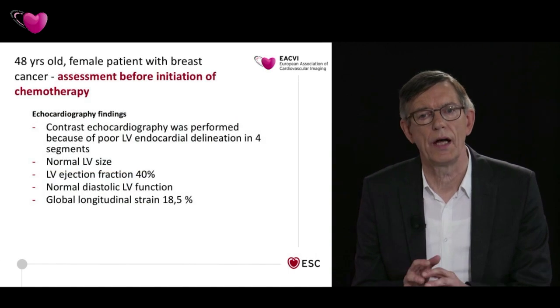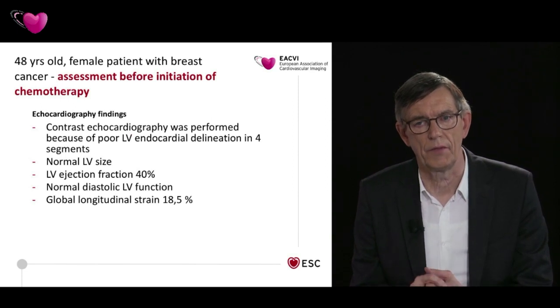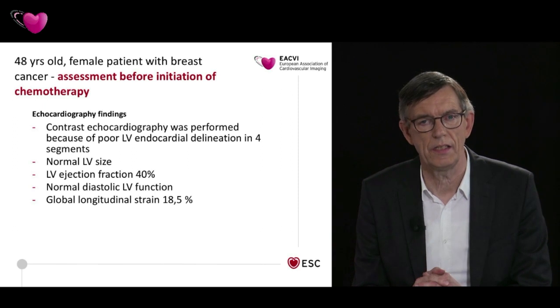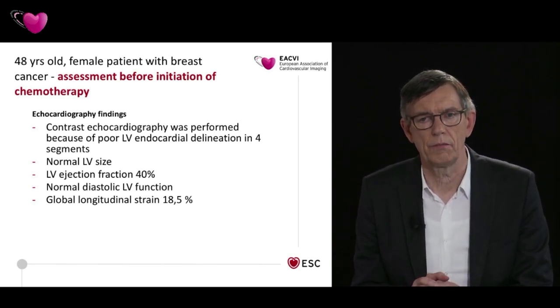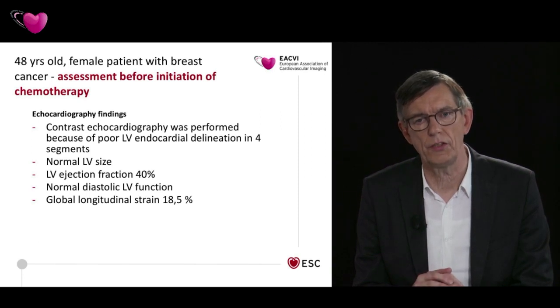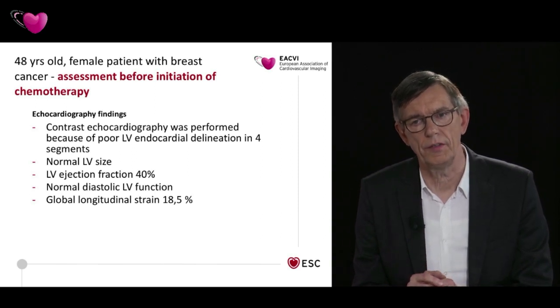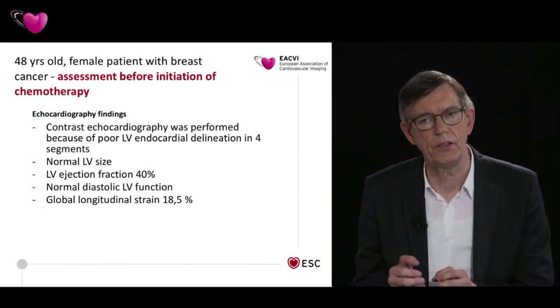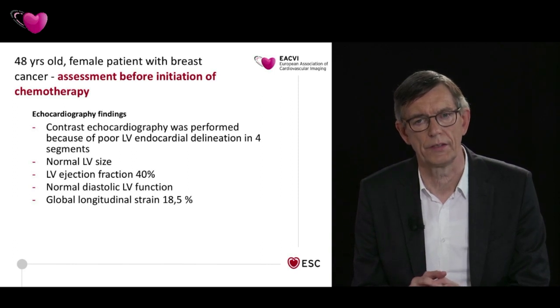Now let's go to a case. I will just give you the results of the assessment, and we'll look at the images later. This is a 48-year-old female patient with breast cancer, and she was assessed before initiation of chemotherapy with trastuzumab, which is potentially cardiotoxic. Contrast echocardiography was performed, as we heard, because it's a standard now, but in this patient, the endocardial definition was also suboptimal without contrast.